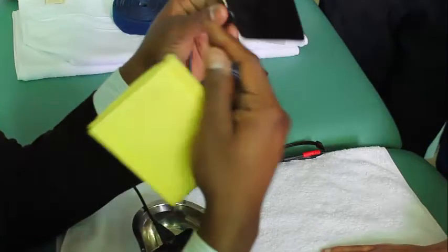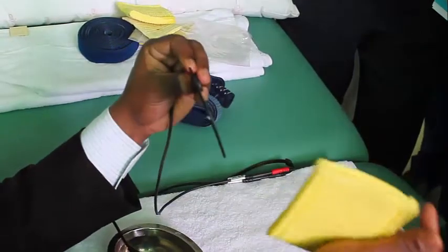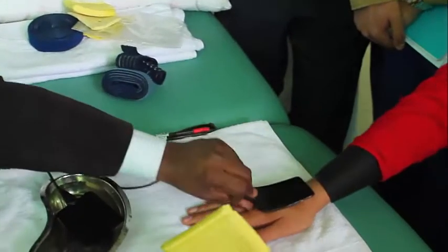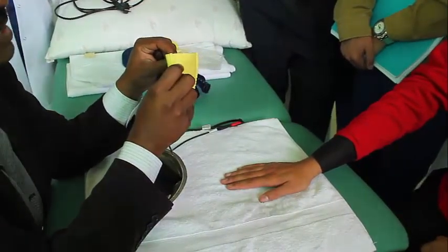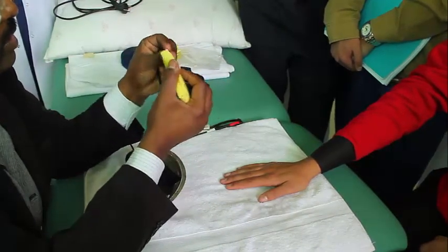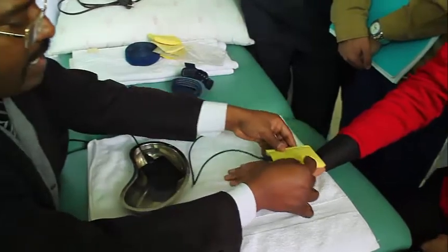The name of the machine. You have to use the other side. Then the effectiveness will be more. If you use this side, the effectiveness will be less. It won't pass easily. So this side should touch the skin. In between this electrode and the skin, I require at least two sponge layers. So I keep two layers. So now this is the contact area, 2 sponge layers, water is there, and I keep it on the skin.